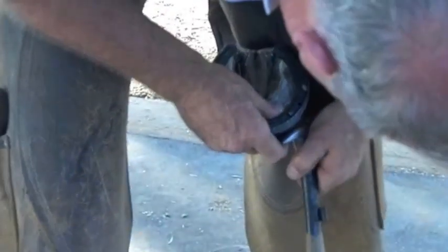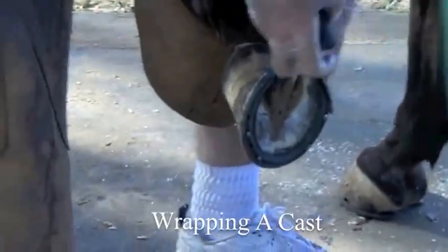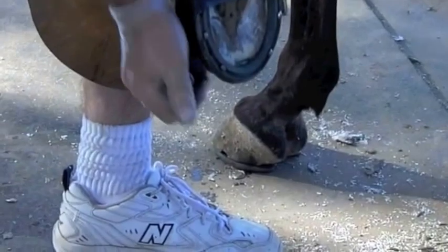Now that we're ready to wrap, make sure that you're ready: that you have your gloves on, that you have your pouch, that you have water in the pouch, and that your stretch wrap is available and your foaming pad is all set to go.